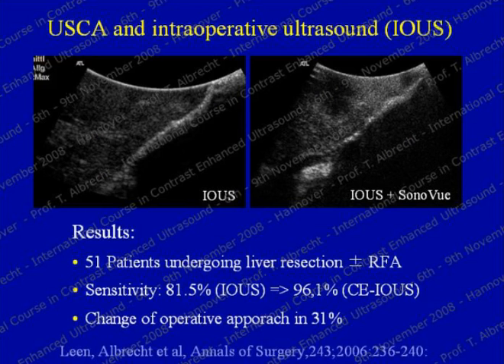This slide you've seen before, intraoperative ultrasound and contrast enhancement. These are the results from a study that was led by Eddie Lean, and we were the second center in that study, recently published. We looked at 51 patients who underwent open liver resection with or without simultaneous radiofrequency ablation, and the sensitivity of intraoperative ultrasound was improved from 81% to 96% compared to the resection specimen or intraoperative biopsy.